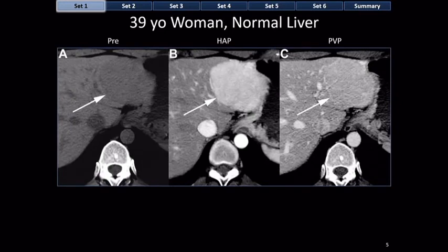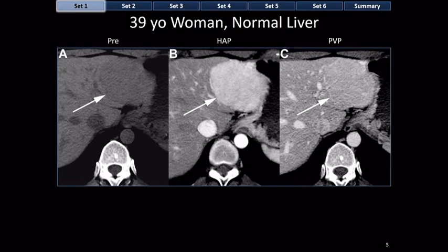A prototypical example: a 39-year-old woman with a normal liver other than a six-centimeter mass, homogeneously and diffusely hyperenhancing at the junction of segments two and three. Notice this mass has diffuse hyper enhancement that is quite homogeneous. Importantly, in the portal venous phase this mass virtually disappears — on a busy day you might actually miss it. The mass has no capsule, no necrosis or heterogeneity, and no obvious fat.